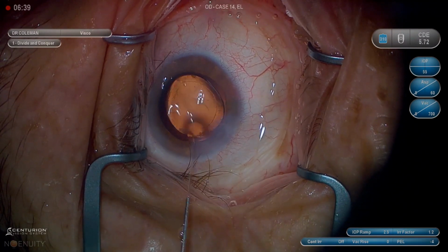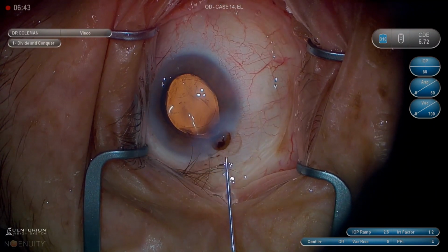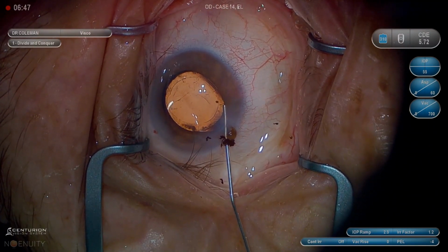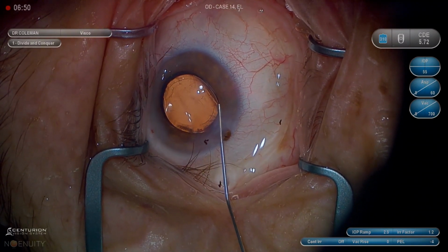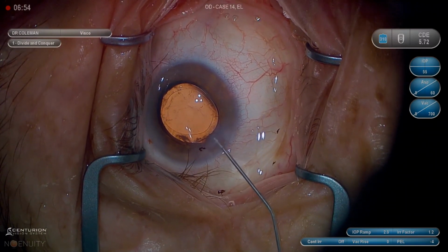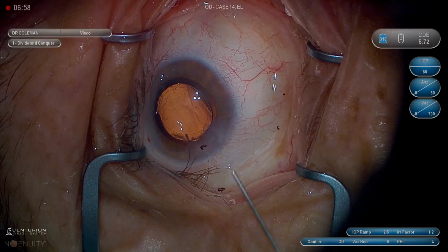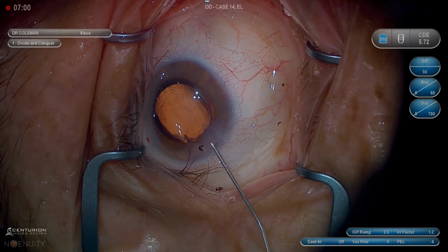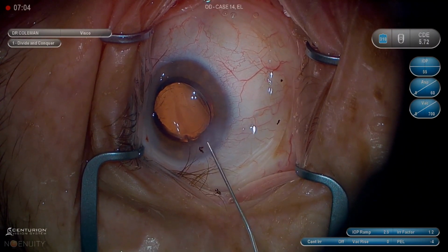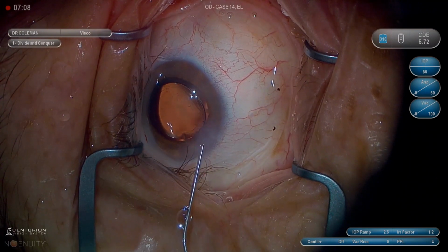I must stop and comment on iris prolapse. That was because of flow. So flow causes iris prolapse. Fluid going in, fluid coming out. And I think I missed in my cortex video a very important point. I'll put it in now: it's the one time you would go to position 0 in the eye. You would go to position 0 if you have iris prolapse. Let the fluid stabilize, the pressure equalize, then ease out. Otherwise, you always want to stay in position 1 in the eye.